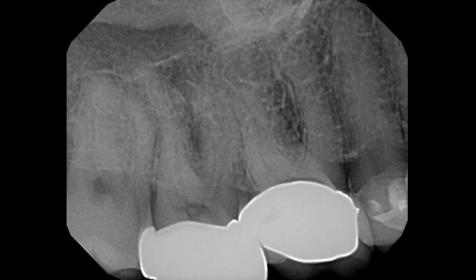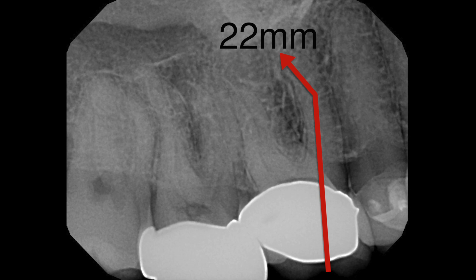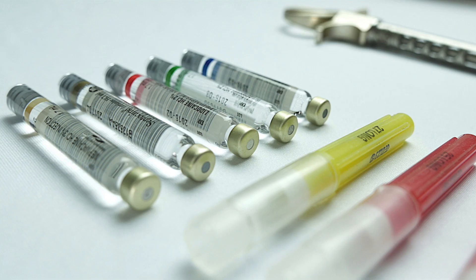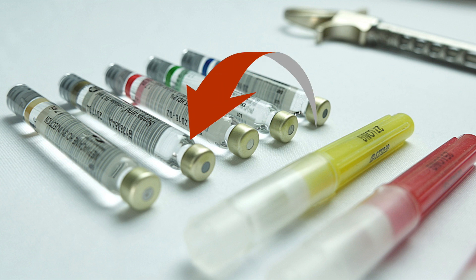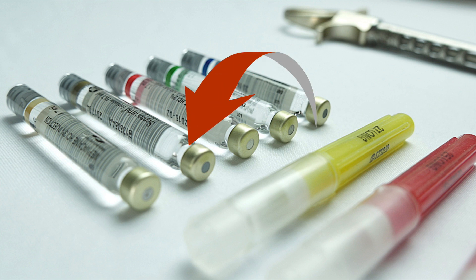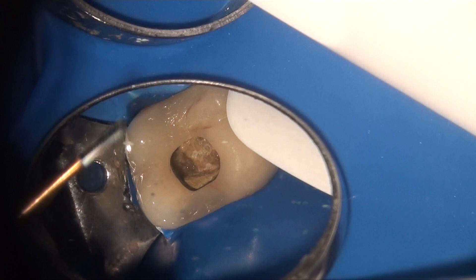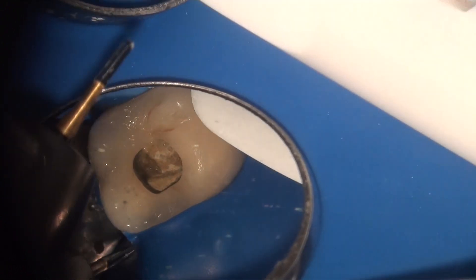An estimated working length of 22 millimeters was determined and the area was anesthetized with two carpules of 4% articaine with a PSA block and a buccal infiltration. The tooth was isolated for access preparation. As you can see the old restorative material had washed out.